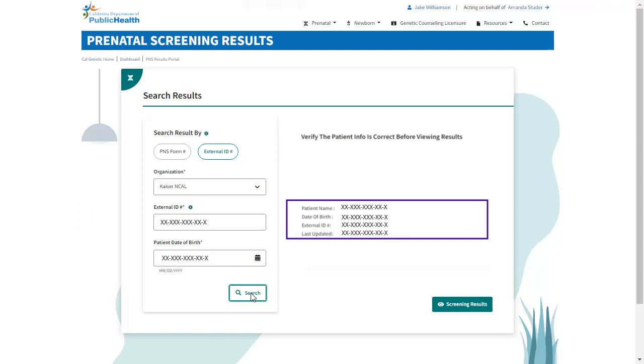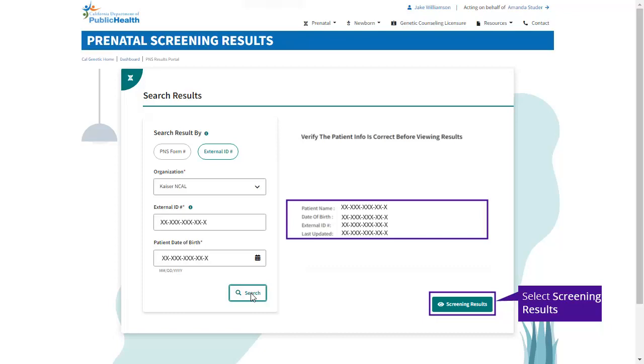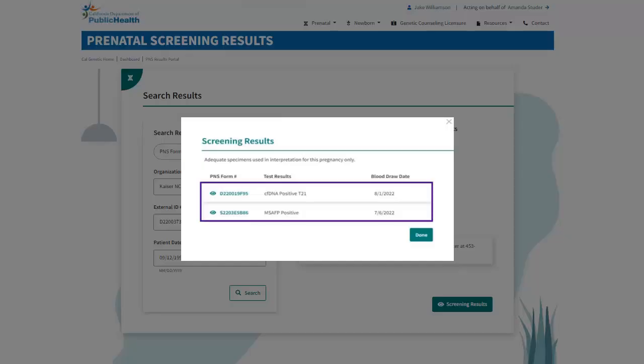You can preview any results found matching your search criteria. If you select the Screening Results button, a screen will display any results available for that specimen. This is a simple way to navigate and view between MSAFP or CFDNA results that may exist for each specimen.